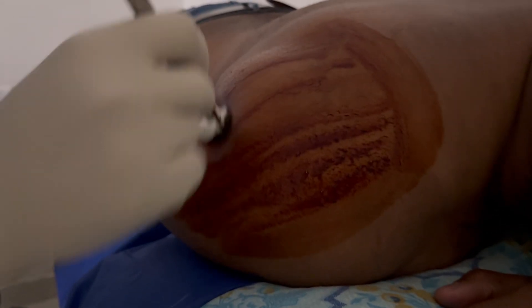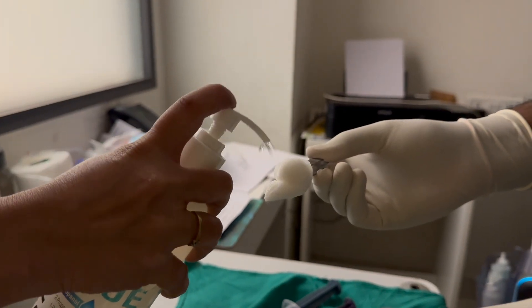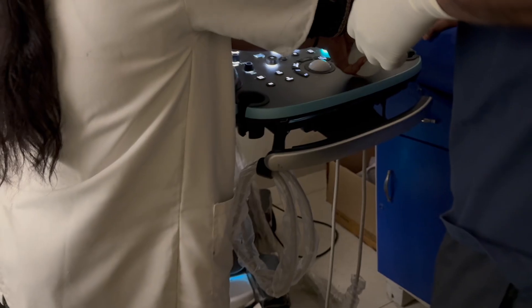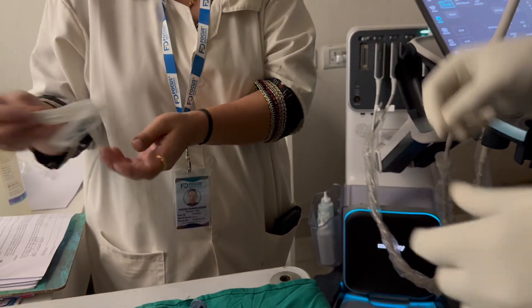The area of interest is cleaned. The approach to the shoulder joint under ultrasound is a posterior approach — cleaning with betadine followed by spirit. In most periarthritis shoulder cases, three injections are done.